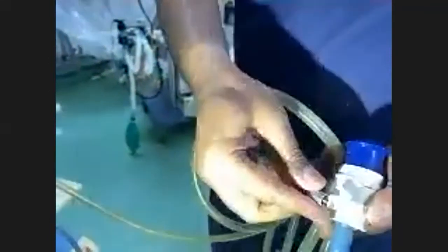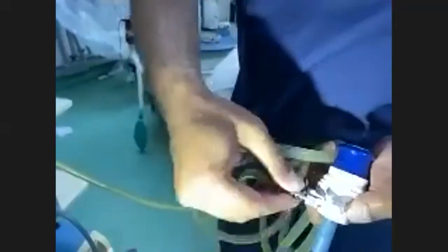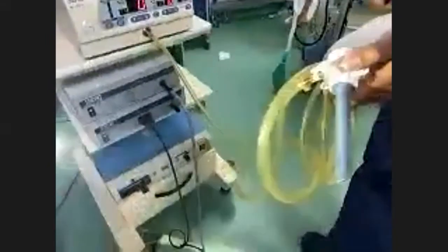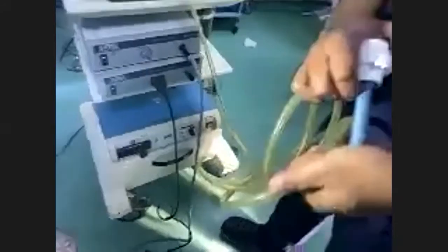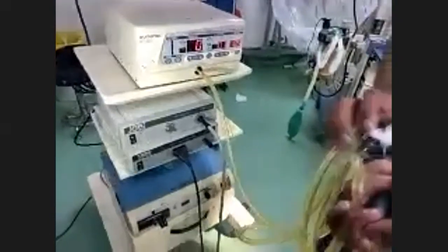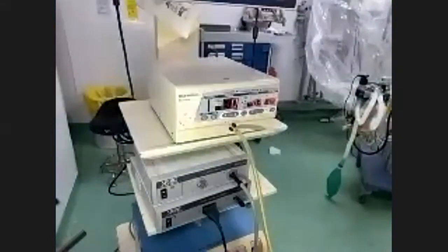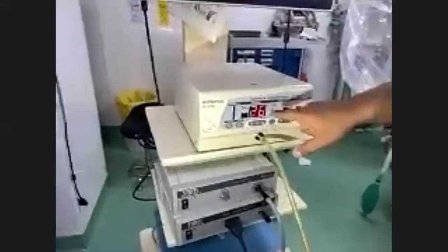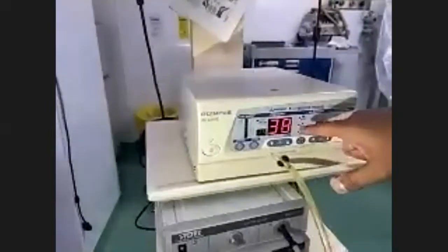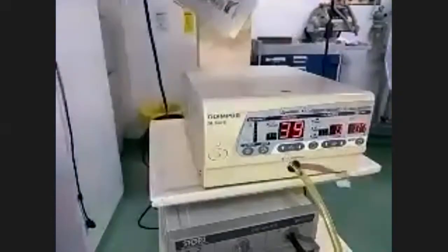Okay. First, you do an anticlockwise and then a clockwise maneuver, and it will get fed. And you open this. And you can hear a hissing sound. If there is any obstruction like this, the pressure will go up over here, and it will give you an alarm as well. Here you see the pressure is going up and it's giving an alarm. It means there's some obstruction or the valve is off. So you will check it.